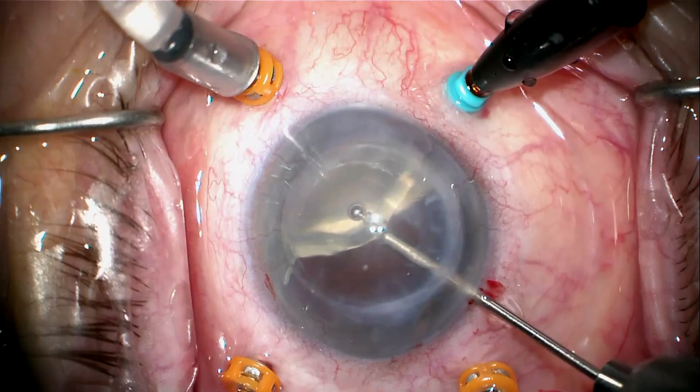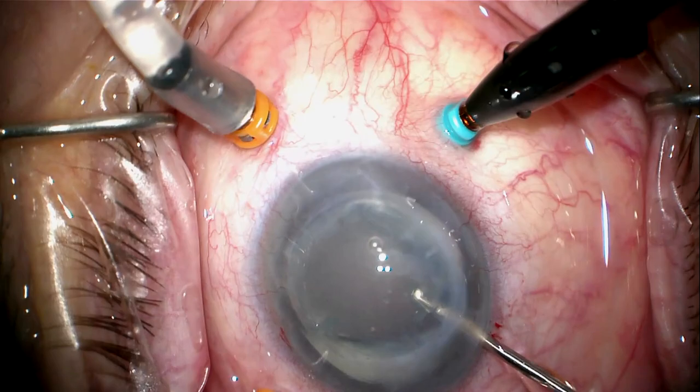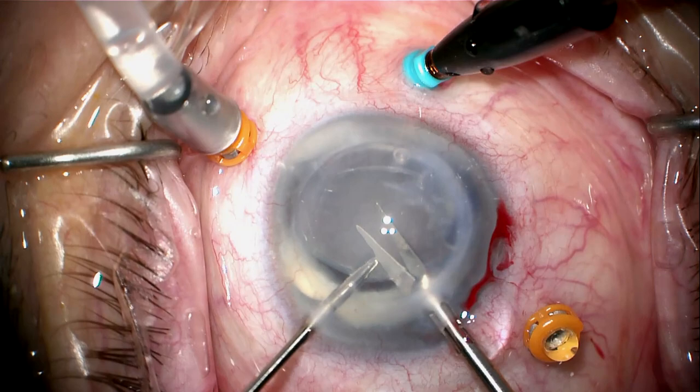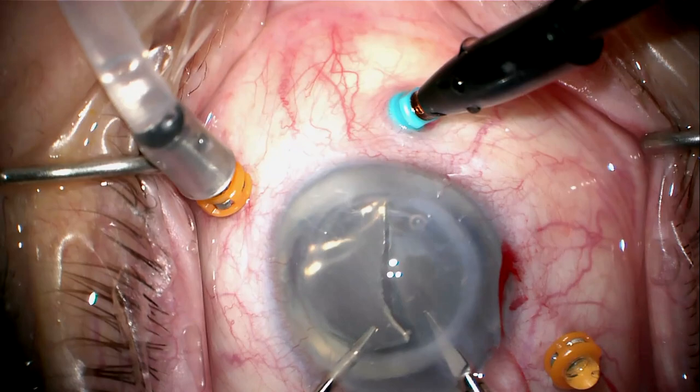I'm going to aspirate this lens-bag complex up off the retina using the vitrector with the cutter off. I'll grab it with a maxi-grip forceps securely and bring it up anteriorly where I can grab it through the limbus with a micrograsper. Once grabbed, I can bring it up into the anterior chamber over the iris, which fortunately dilates fairly well. Now the lens-bag complex with all the Sumrins ring material is in the anterior chamber.